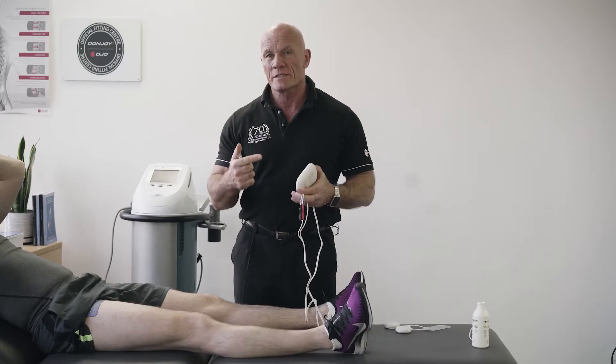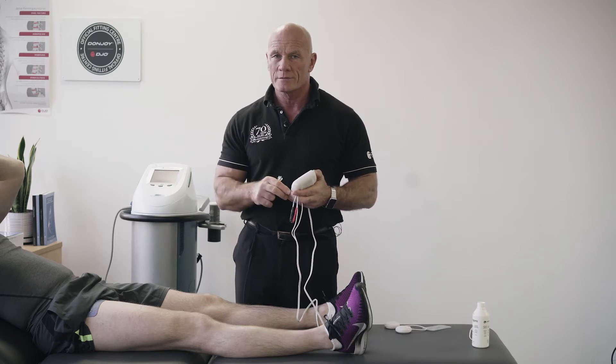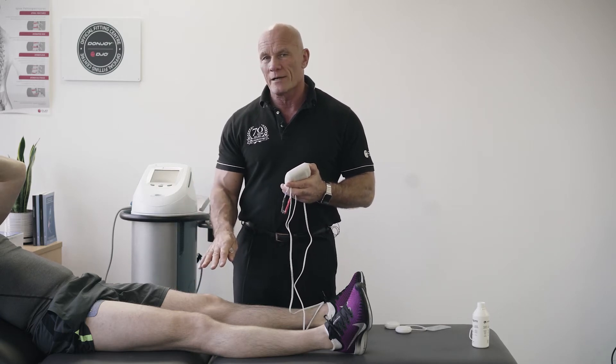The most effective, comfortable and safe place to put your electrodes is over the motor point. We know from Gobo's work that the motor point in the lower limb can occur anywhere. Burr-Ringer mapped them out in the upper limb and also found they occur anywhere.